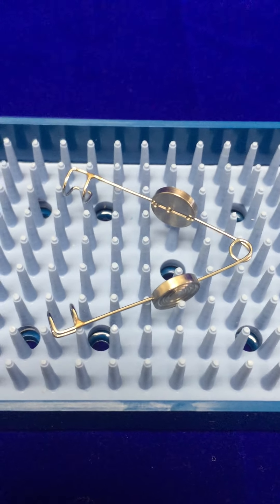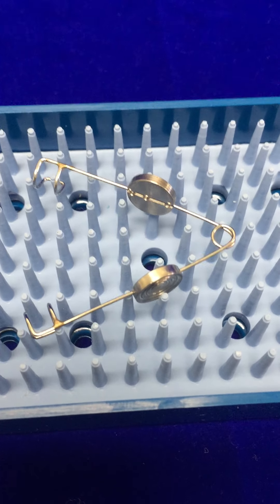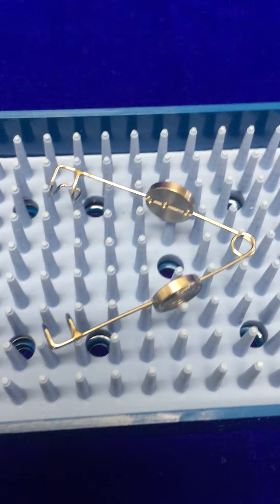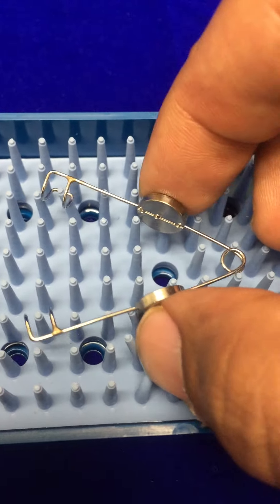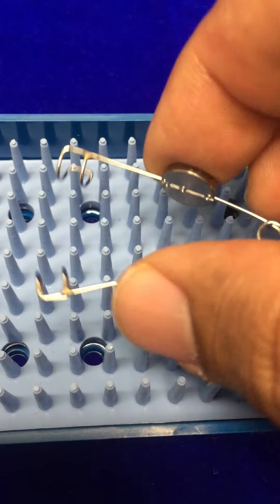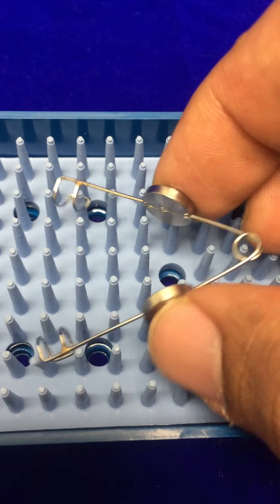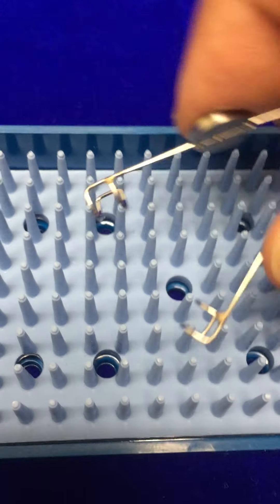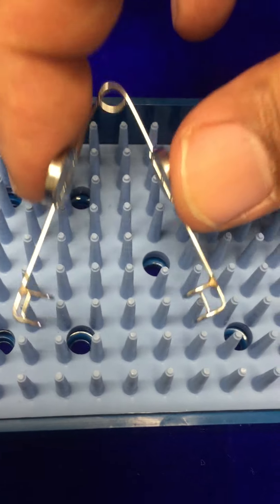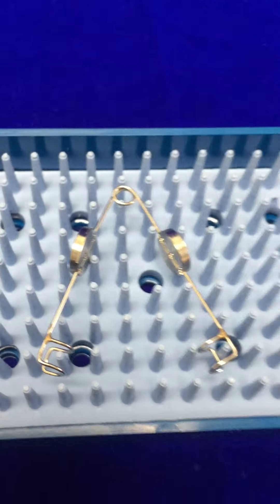This is a lid speculum with a 5mm blade. As you can see, it has two little buttons here that will help you hold the speculum, and the lids are 5mm.